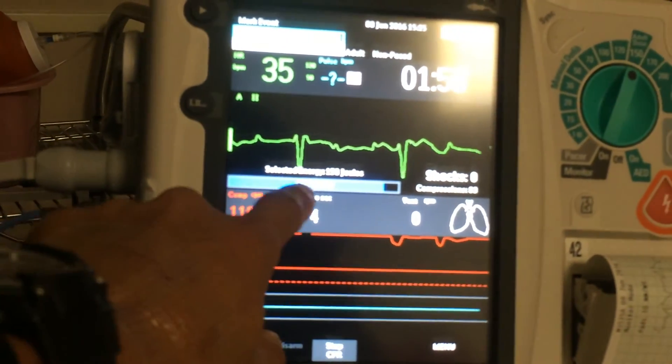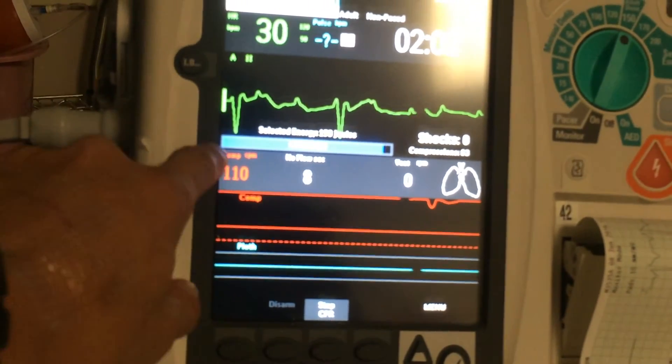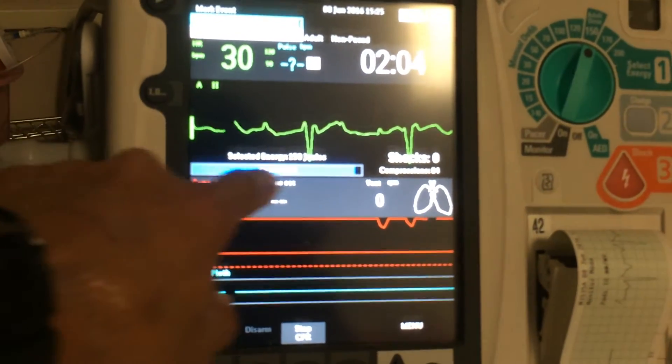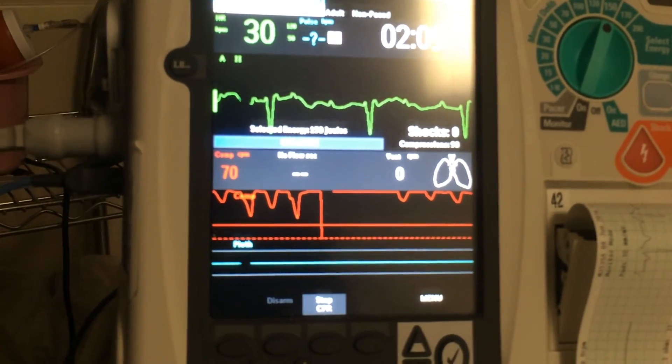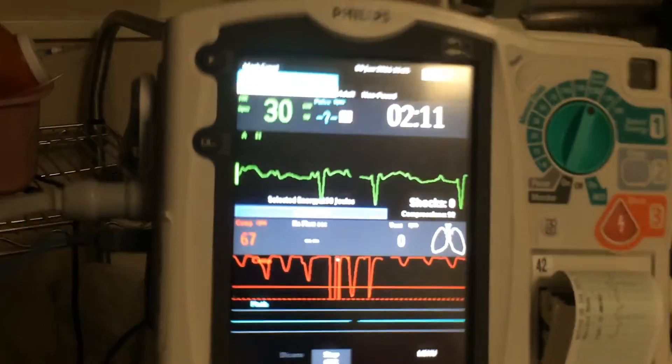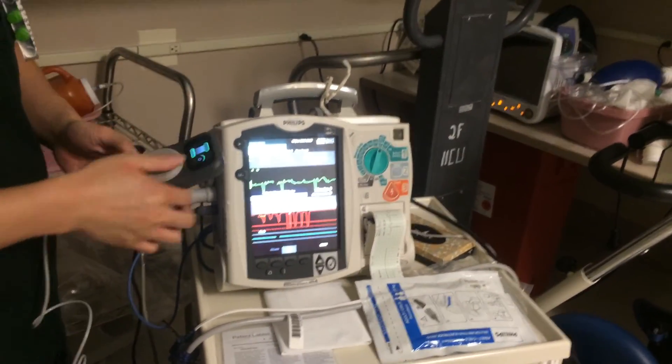On the monitor it shows the rate, and also right here this blue line is the CPR clock. Once Brandon started manipulating the puck, that goes for two minutes — when this blue line goes all the way across, that tells you when a full cycle is up. That's it for using the QCPR puck.